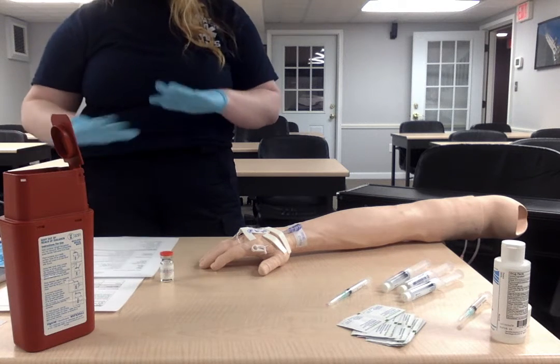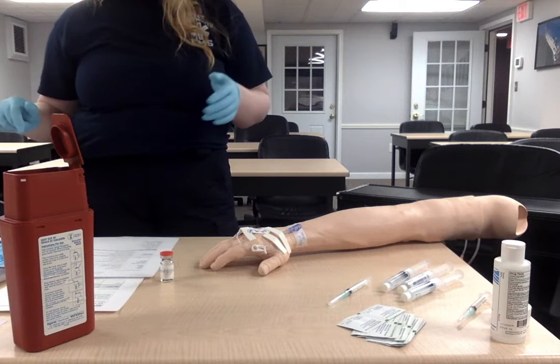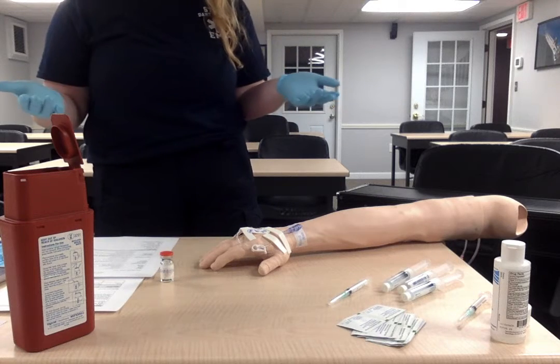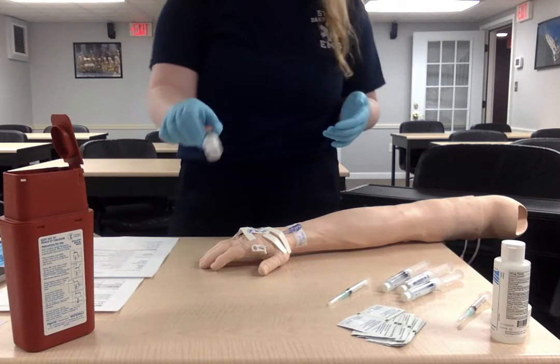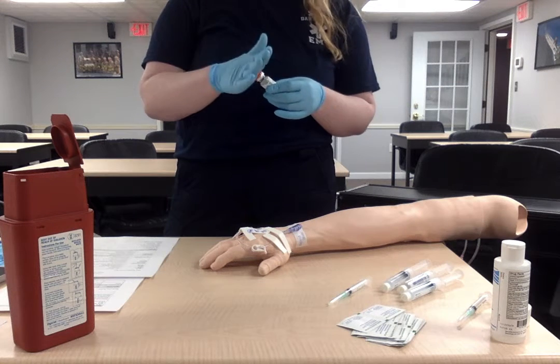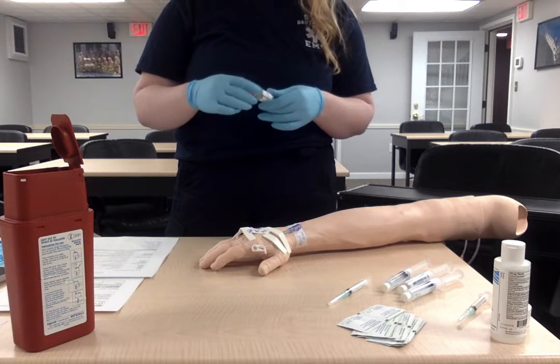everything's ready. We're going to look at all our material, make sure that's good. We're going to prepare our medication. Like I said, it is 0.25 milligrams per ml, so we're going to need 2 mLs to meet the 0.5 milligrams. So we confirm expiration date, again checking for right drug, making sure there's no expiration, making sure there's no particles or anything, right patient, anything we might need.